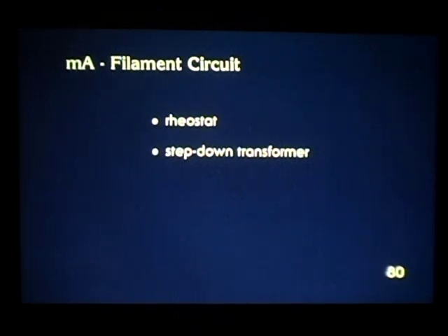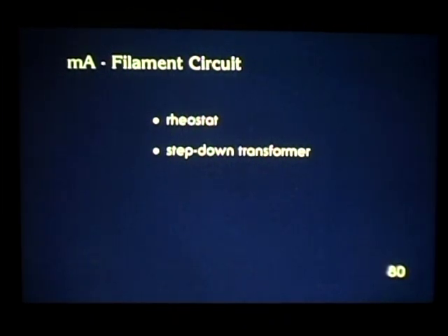The exposure time, the length of time that X-rays are produced by the tube, is controlled by circuits that are usually located on the primary side of the tube circuit, on the primary side of the step-up transformer. Timer circuits are usually on the primary rather than the secondary side of the circuit because the voltages are lower there and the circuit is more easily interrupted. An alternative to a timer set by the radiographer is the automatic exposure control system. In the AEC system, a sensor located near the image receptor stops the production of X-rays when a sufficient number of X-rays have penetrated the patient.